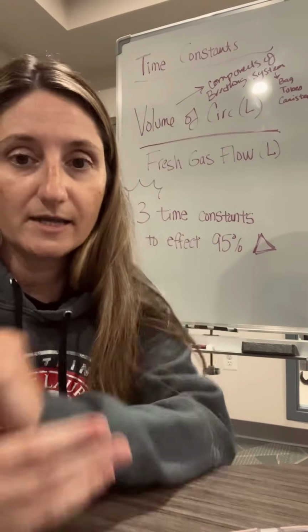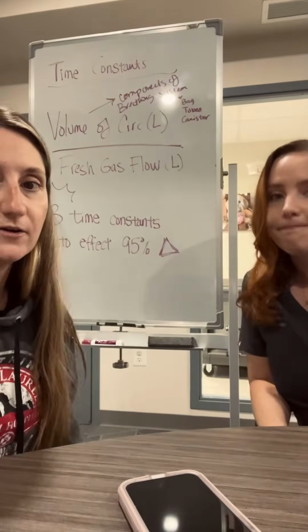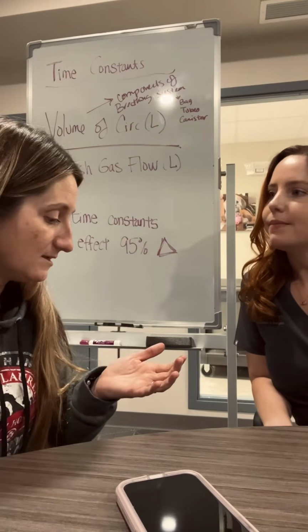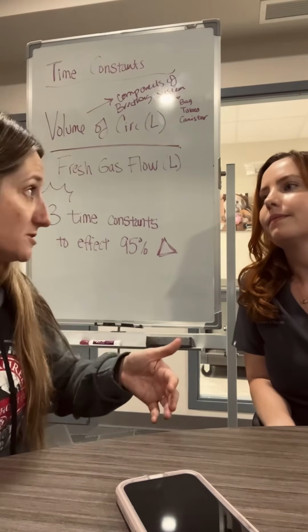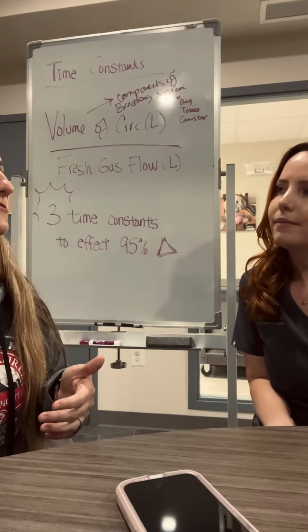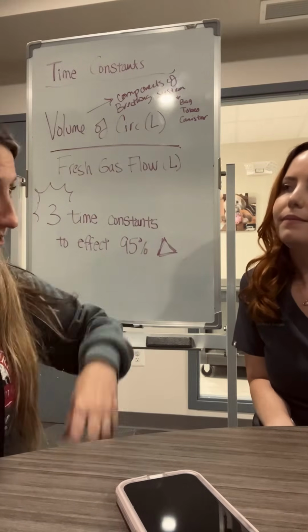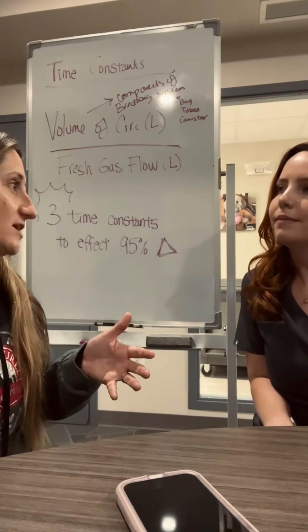What we're talking about is sometimes we have patients under anesthesia. Meagan, this might have happened to you as well in your career, but what people are saying is that they have a patient under anesthesia and the patient starts to react to a surgical stimulus, and then they think, well, should I turn up my vaporizer? Should I turn up my flow meter? Which one should I do?